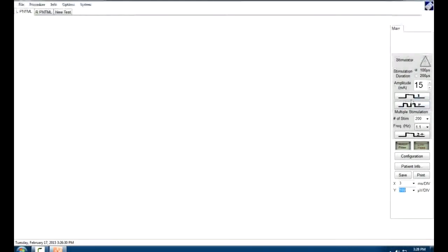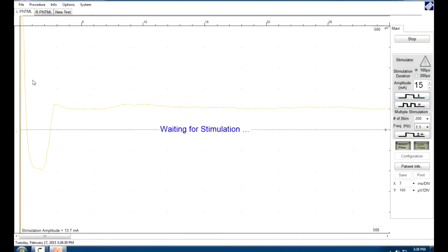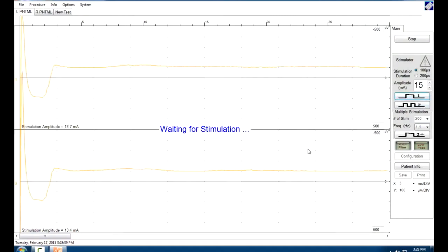It's a good idea to do one stimulation first. When you do that, you'll see that it comes up in the middle. It says waiting for stimulation. Then it gives you one waveform. If you've got a good waveform at that time, you can just go ahead and do another one, and those could be your two waveforms. However, most people aren't that lucky, you don't find it initially.